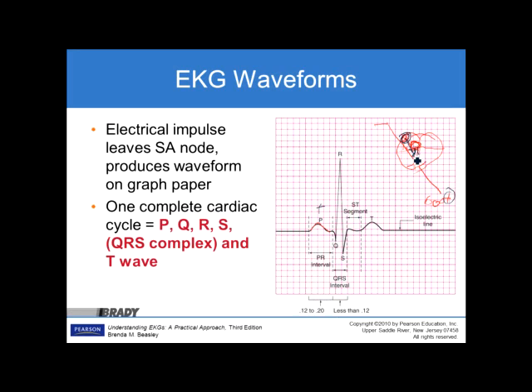After that point, it gets back on track and heads towards the apex. This spot in time and this spot in time are the same one. As it turns negative, this is the electricity traveling back towards the negative electrode. The repolarization occurs here and hopefully is in the same direction, which is this way, as our depolarization wave or our contraction.